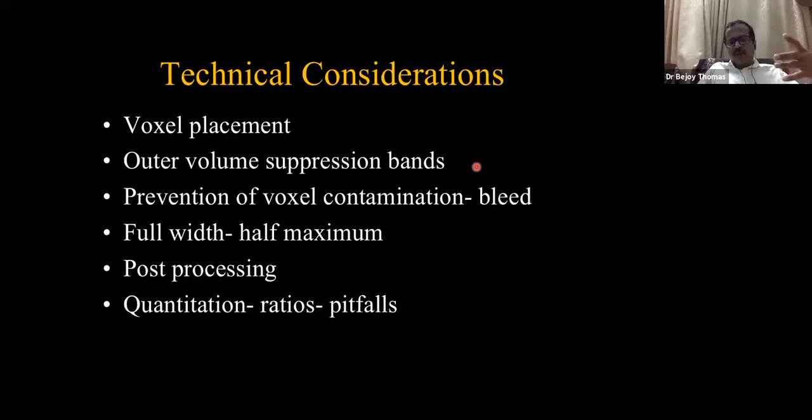That is depicted by the full width at half maximum. These are all technical things which I will not go into in detail. But you should always insist that radiologists monitor this when the spectroscopy is being done. And the post-processing techniques and the ratios matter too, and we will talk about the pitfalls of spectroscopy in this talk. This is how you do a spectroscopy.